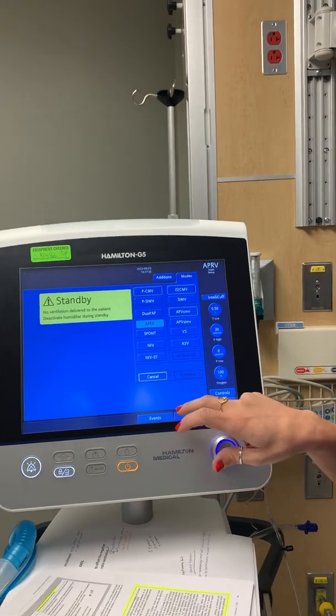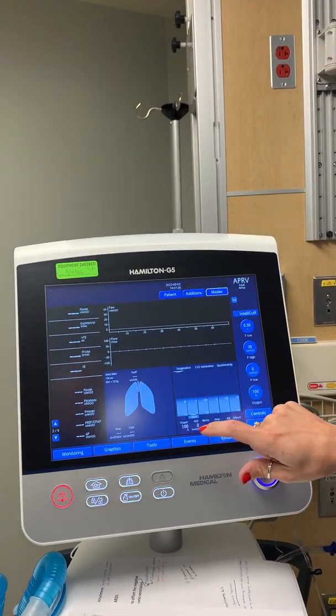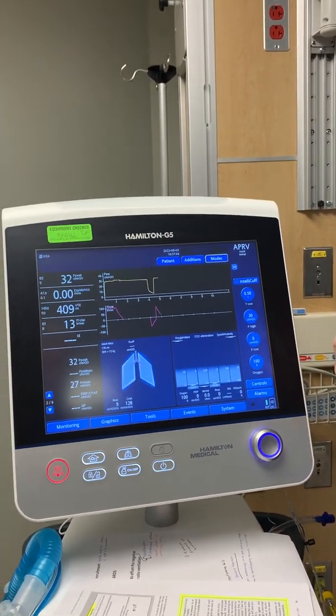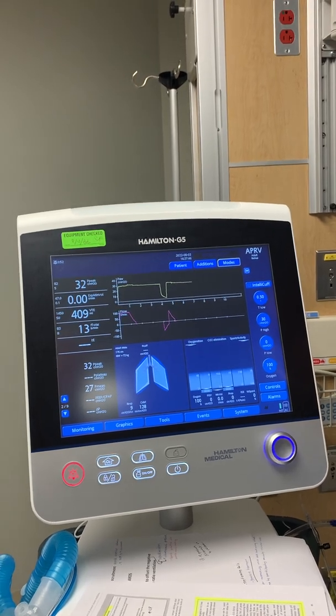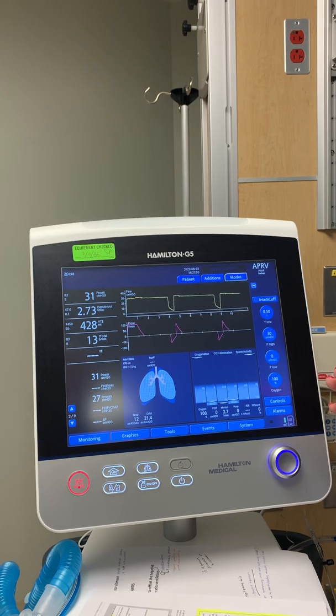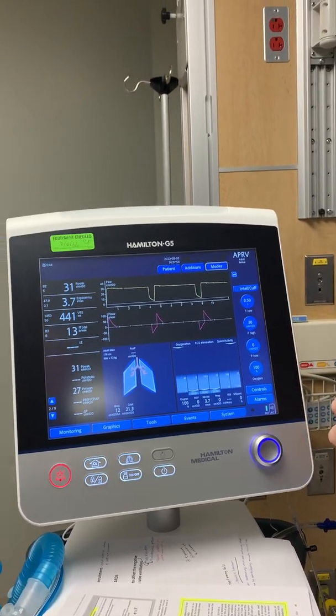Hitting APRV, just by listening you can hear that it's an inverse ratio ventilation — it has a really long inspiratory phase at a high PEEP. That's going to be your P high, which helps recruit the alveoli.